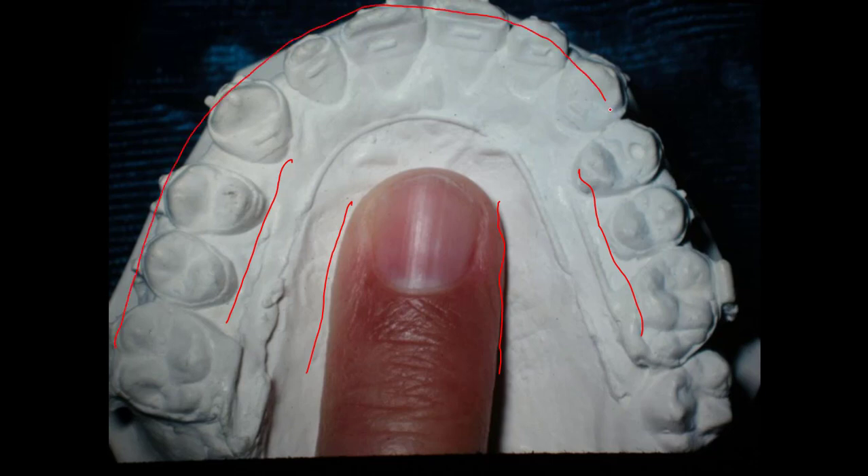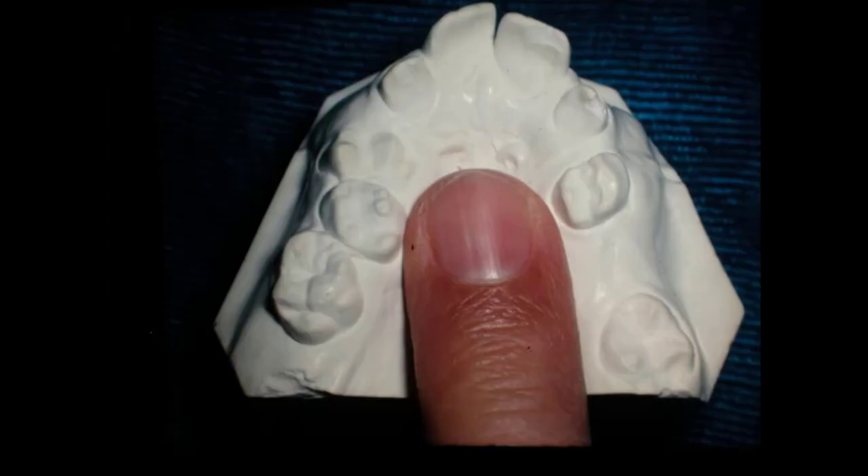So we put that palate that was messed up like that back together. I'm going to back up and look at where that was to start with. Isn't it incredible that you can come along with some orthodontic appliances — I use bands — and do this whole thing and change this person's life? There's no way about it.